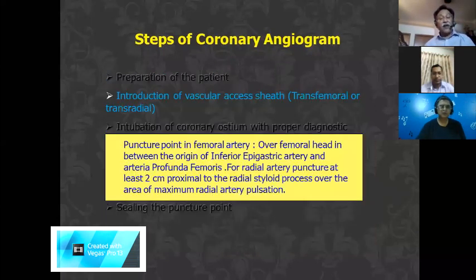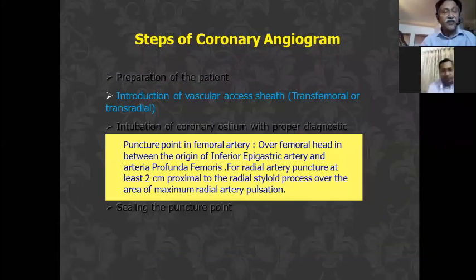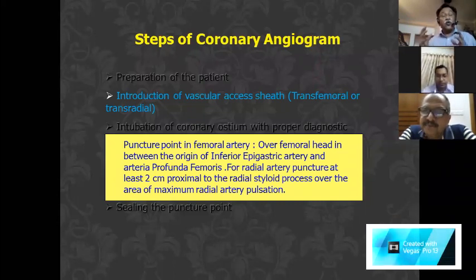The next step is the puncture site. As I said, the puncture site is commonly the radial, but you should also know the femoral. In this connection, I want to tell one story. 15 or 20 years back, our general surgeons did gallstone operations by opening the abdomen. But after laparoscopic surgery came, they only knew how to do laparoscopic cholecystectomy, and at least 5 to 10% of patients may need the abdomen opened.